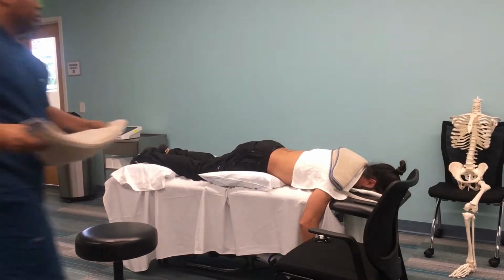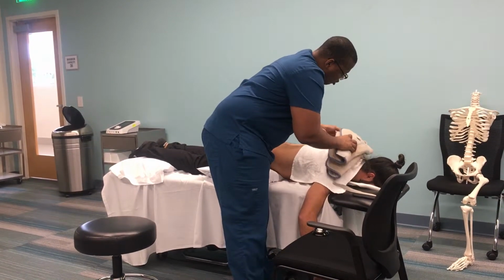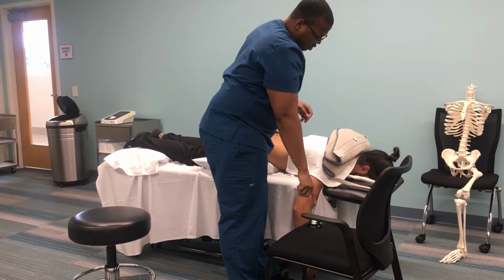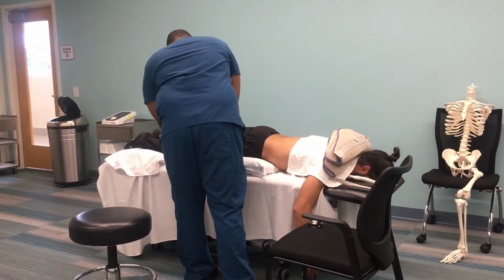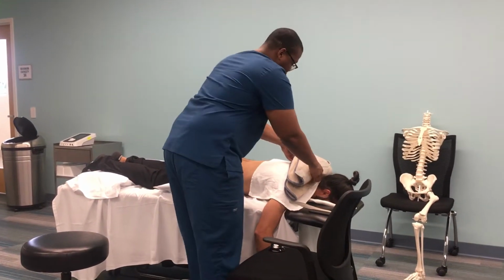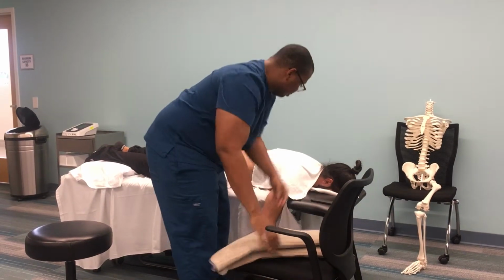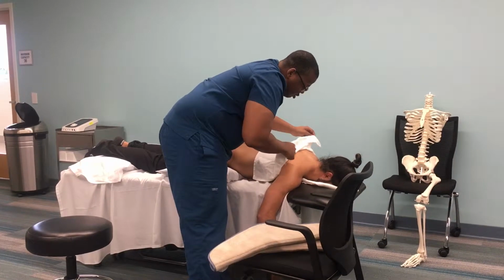So, Mr. Machado, remember what I told you? If at any point you feel any discomfort, I want you to find a call bell. So I'm gonna set this timer for 5 minutes, and I'll come back and check on you. Okay. 5 minutes pass, I'm back, I'm reassessing the patient. Okay, everything seems fine, normal. How do you feel, sir? I feel fine. All right, good.